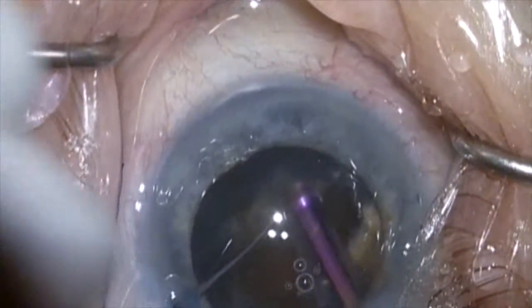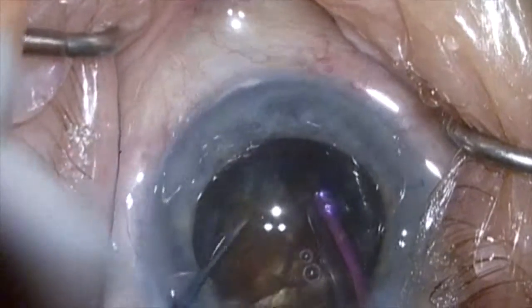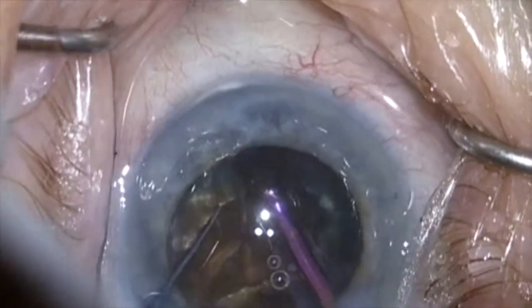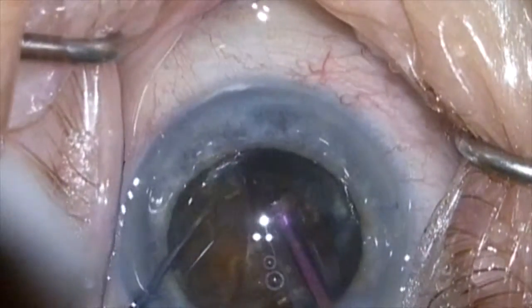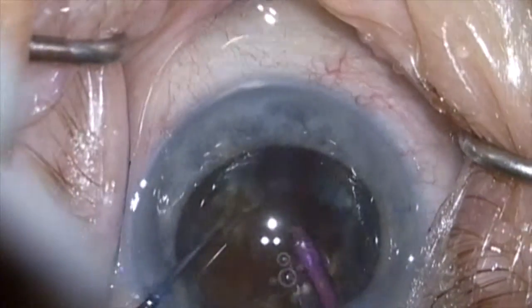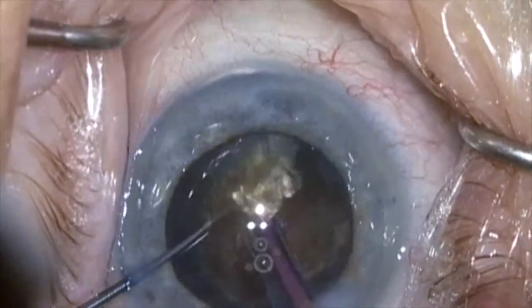I'm using a simple Sinski hook as it gives me very good control, and I can reach in and tear off just a small piece to get things going. This is a very tenacious and thick leathery lens — it doesn't really crack that easily — so I have to tear these pieces off piece by piece using fairly high suction, holding the rest of the lens back with the Sinski hook as I tear with the phaco needle.